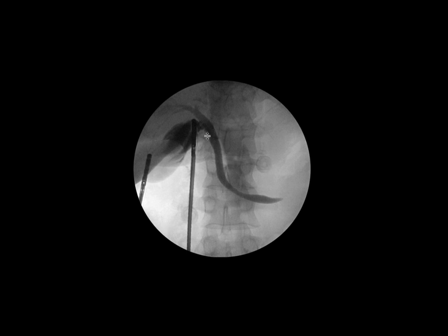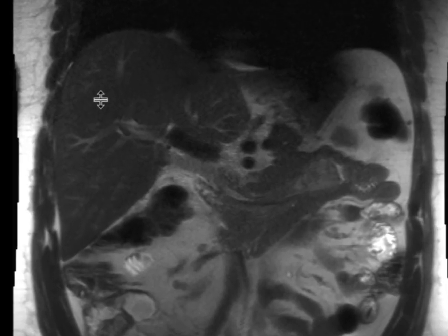What we can see on the cholangiogram is that the common bile duct takes an unusual course — it's deviated a lot more medially than would be expected. This was noted and a subsequent study was performed to figure out why this anatomy looks this way.